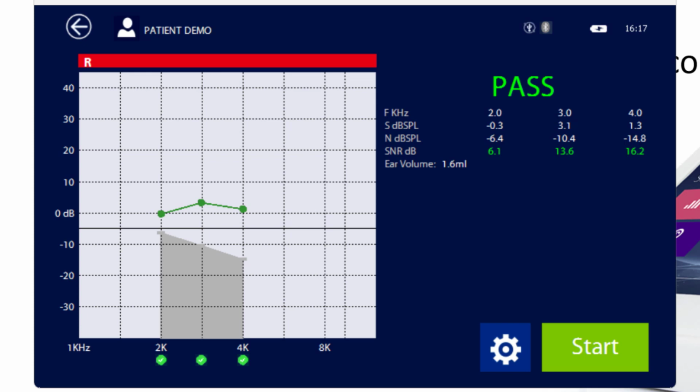If you try the OAE in a noisy environment like an exhibition, the whole noise floor will just increase. We can see the noise floor is actually higher than before. But the best demo is in the hospital on a real patient, because if the patient is not fully cooperative, a patient will not always be noisy, so it will still manage to make use of the silent times.